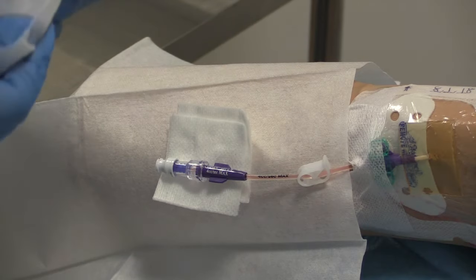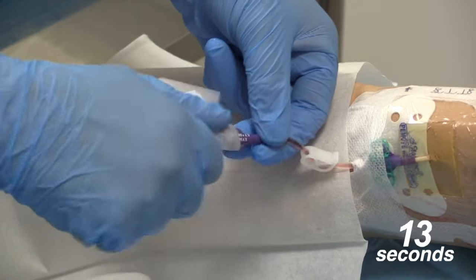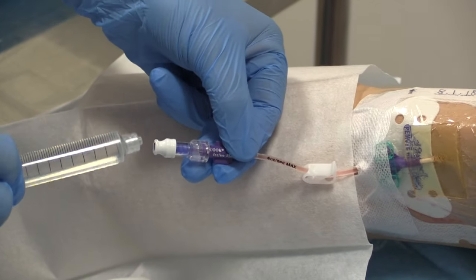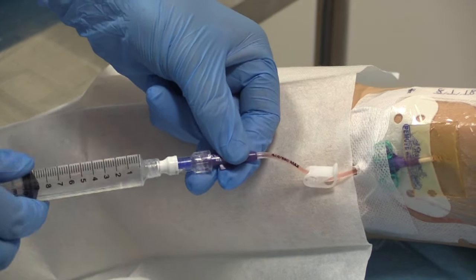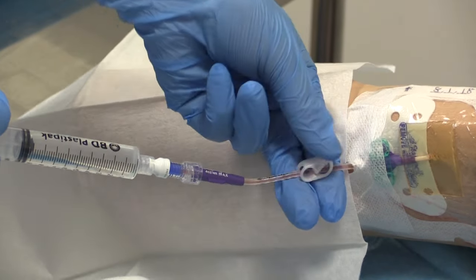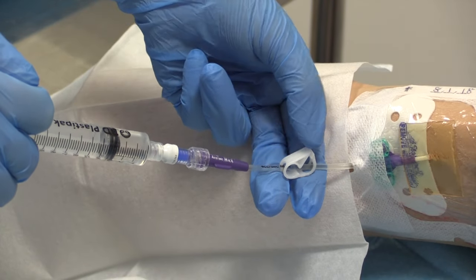Taking the second Clinell wipe, re-scrub the hub for 30 seconds and again allow to dry for 30 seconds. Taking the pre-filled syringe of normal saline, apply pressure onto the syringe, unclamp the line, and using the push-pause pulsating technique, flush the line.